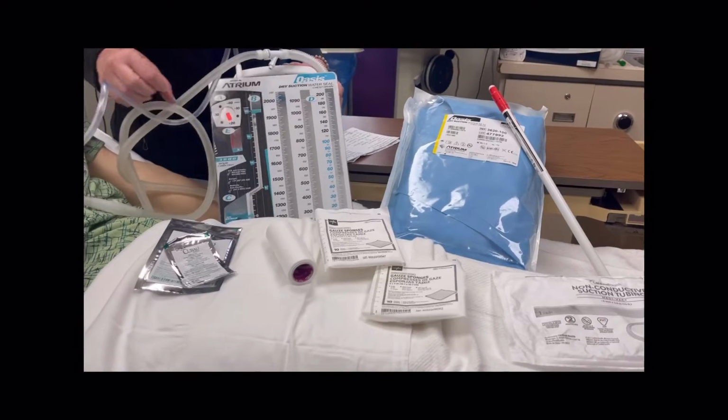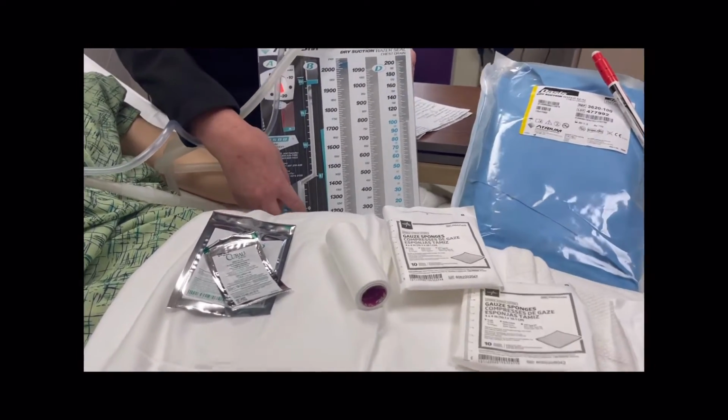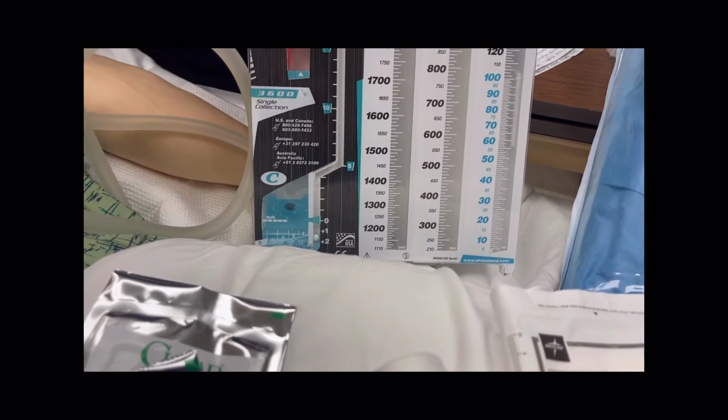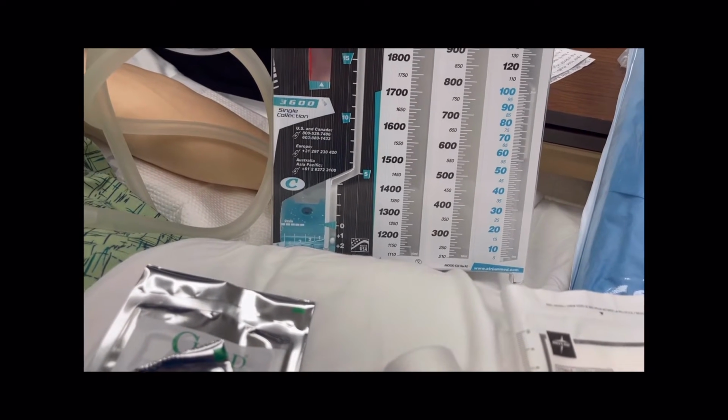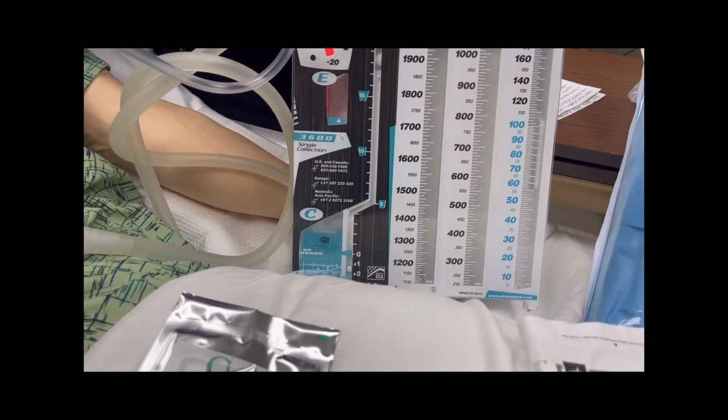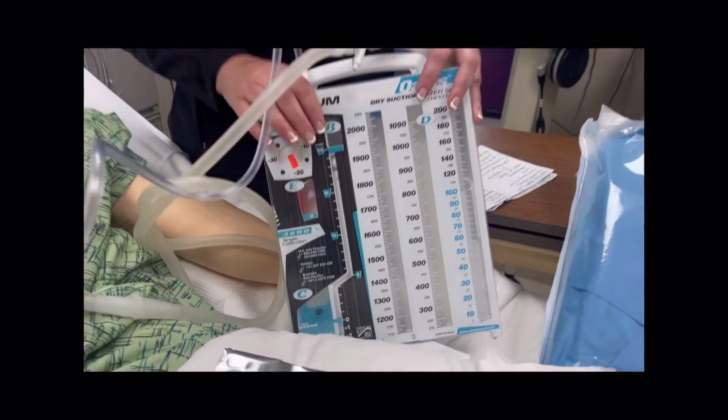You will see tidaling. Tidaling is normal. This little ball will come up and down. That is normal. That occurs with inhalation and exhalation. That shows you that the device is working correctly. What do you do if your device is full?